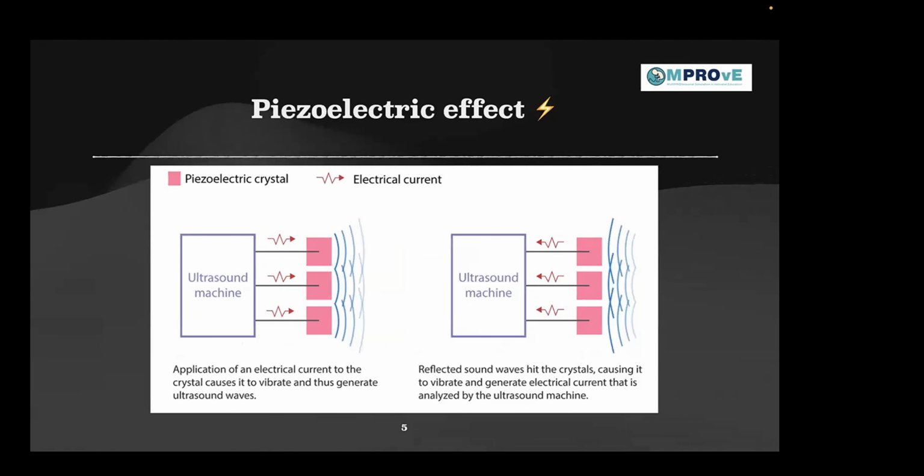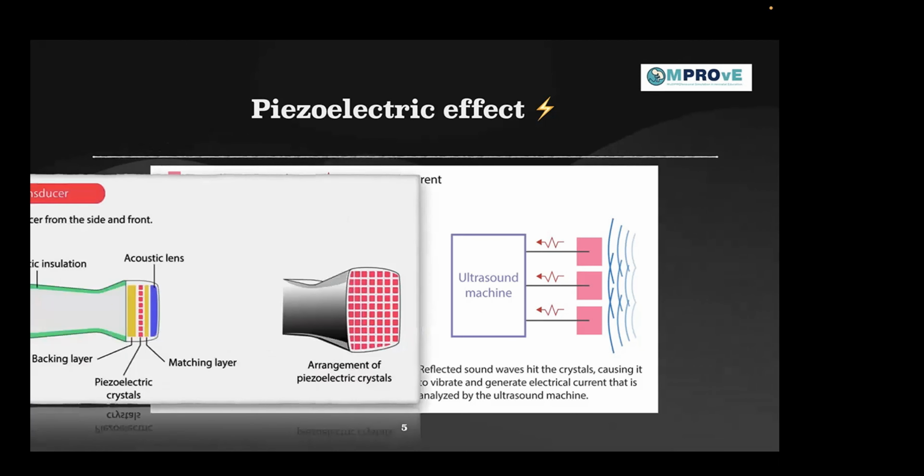It's about the crystal where you apply some electricity and it gives out ultrasound waves. And as the name suggests, the ultrasonic waves are beyond the range of 20,000 hertz, which is beyond our hearing range, and hence they are called ultrasonic. Piezoelectric crystals also have the property that when they receive sound, they generate electricity, which is decoded by the scanner and gives us an image. So that's the piezoelectric effect. I'm not going to talk too much about it.